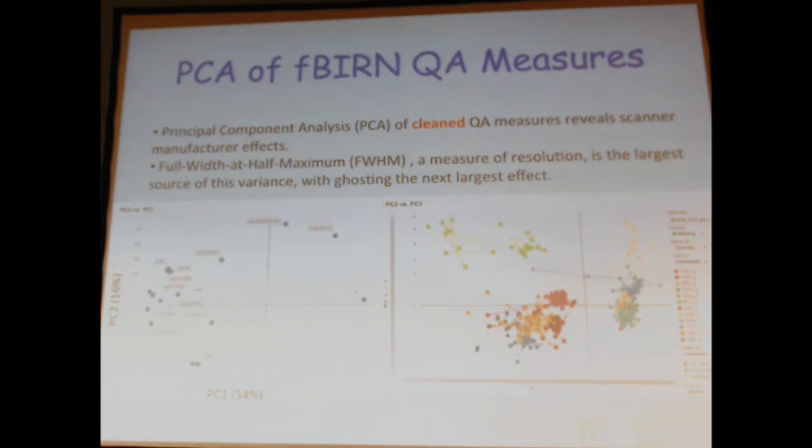And then we threw all of these into a principal component analysis, and on the left here, we have the 2 components, PC1 and PC2, so the highest variance, second highest variance. These are the weights or the saliencies of each of the 16 parameters. And on the right, you have the distribution over the actual phantom scans themselves.